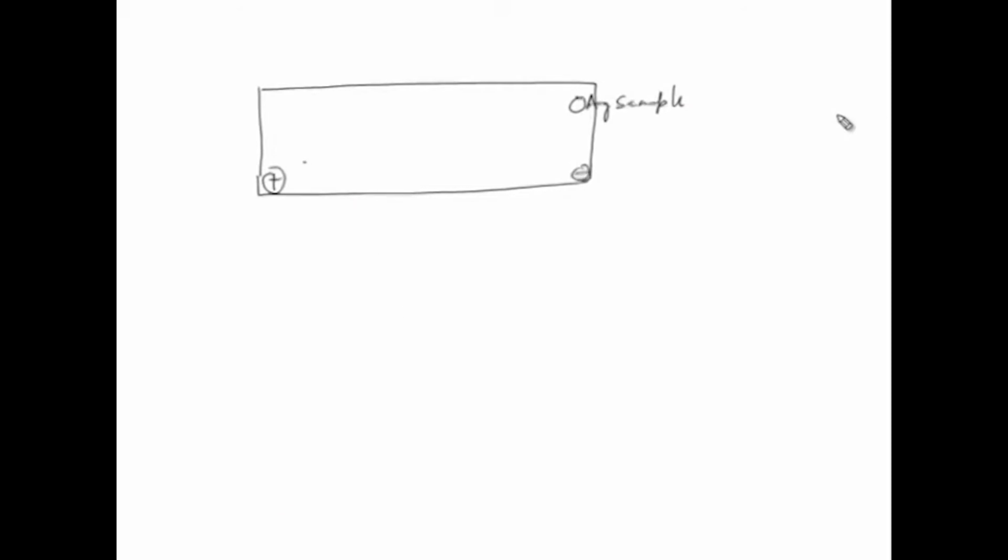What you have is a simple microscopic glass slide, and you have a particular antigen sample, a particular antigen mixture. Now, there will be a longitudinal trough in here, which is cut in the gel only.